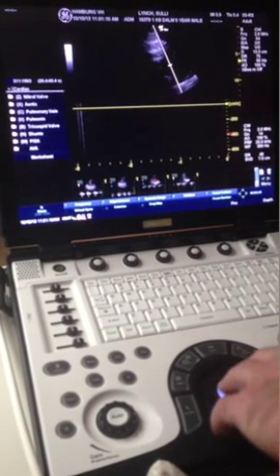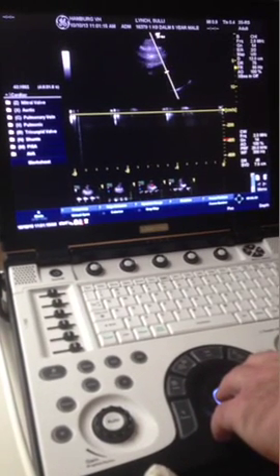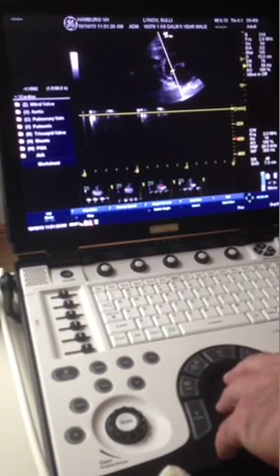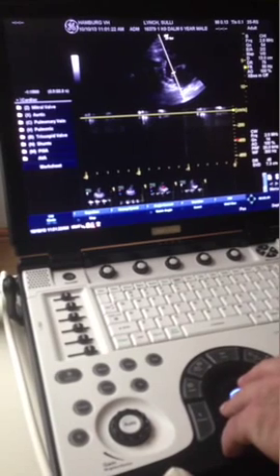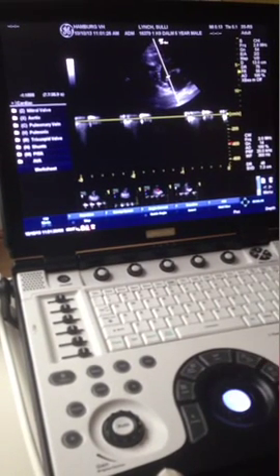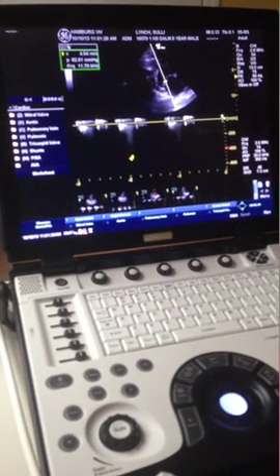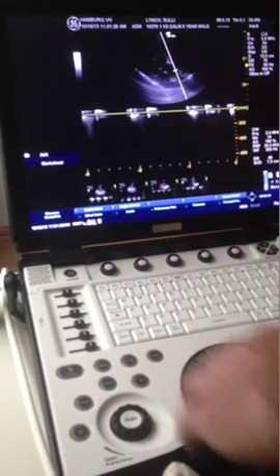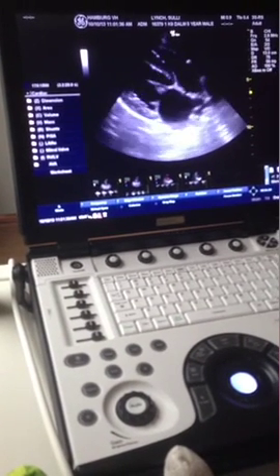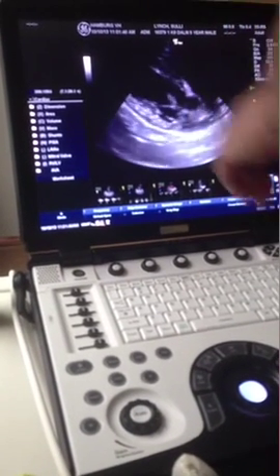I'll take a different angle at it — I'll move caudally and get the cursor at an angle of 15 degrees theta to the insufficiency jet. You can see that the velocity increases significantly as we get lined up with flow — about 4.79, which is still probably underestimated, but it's a lot higher than the 2.7 we had. I'll try to get more in line with flow again. This dog is not volume overloaded so his window is not real big. He's got a slight prolapse of the mitral valve.